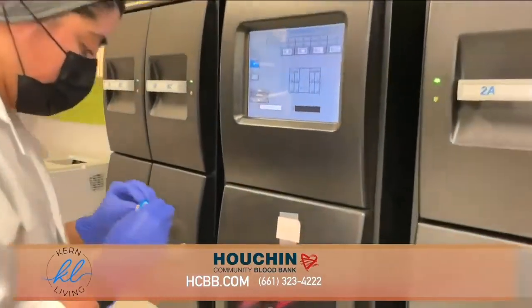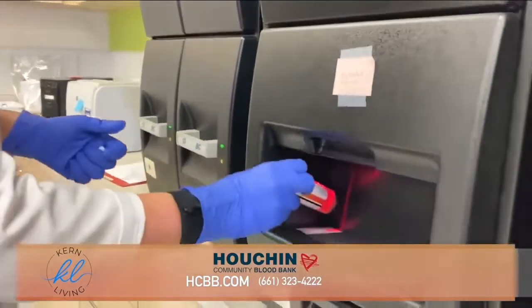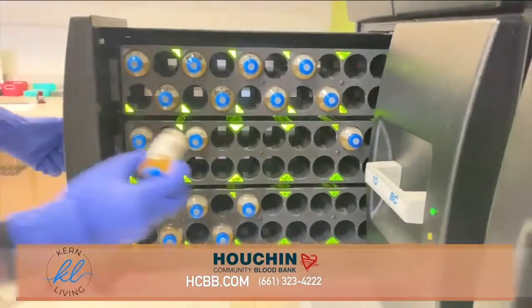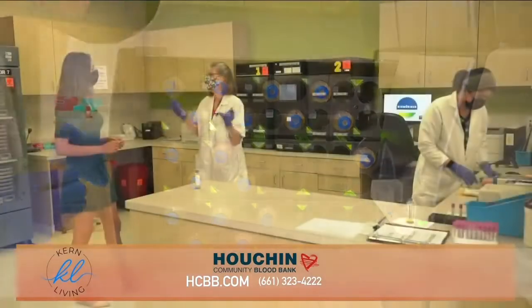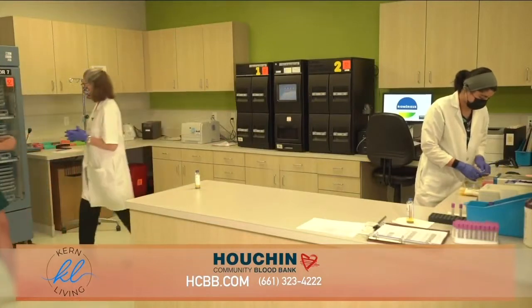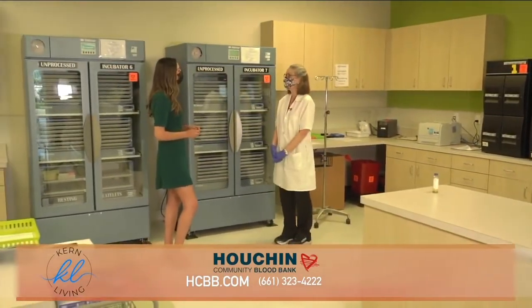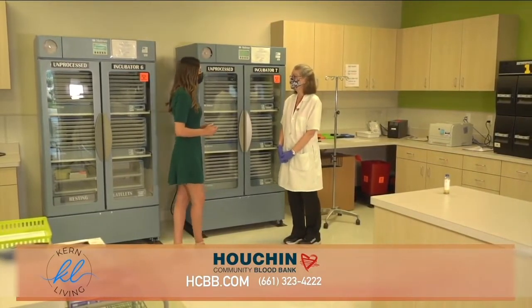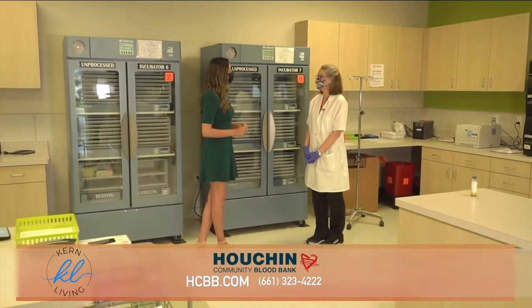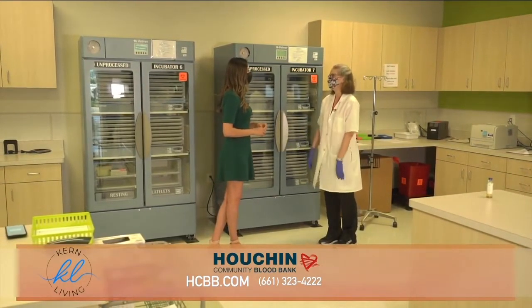After the culture is performed, she will go over to that area and she will split the platelets. If a donor donates a triple, that can be 3 platelet products and life-saving components. After she splits them, they come over here and they continue to move until we get all of the results of our infectious disease testing. And once everything is negative and we've received the results, we're ready to label the product and distribute them through the community to save lives.